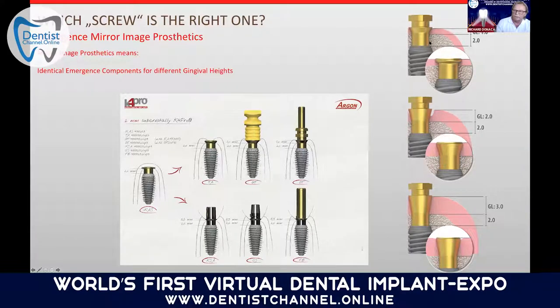And you can see here, this is the theory behind mirror image prosthetics, to have the extrusion and the emergence profile all in the same contour. So if you have a 1 millimeter extrusion, then you need to have a 1 millimeter contour. 2 millimeters, 2 millimeter contour. 3 millimeters, 3 millimeter contour. This is the theory, to have all the components giving you the exact same emergence profile.